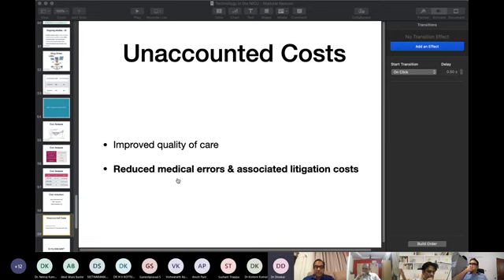Then the second thing is regarding the monitor. Sushanth was telling it is better to go with the basic one, but a higher end machine, because anytime you might need an upgradation. Some companies, for example BPL, have incorporated this. They have SpO2, and if the SpO2 comes down, it has an apnea monitor. It will first shake the baby's leg with a vibration. If it happens more than 3 times, according to the definition, it will give an exact alarm that the baby is going for repeated apnea.